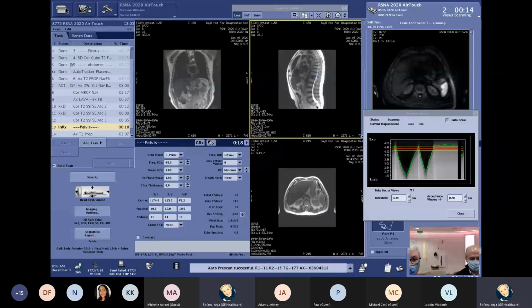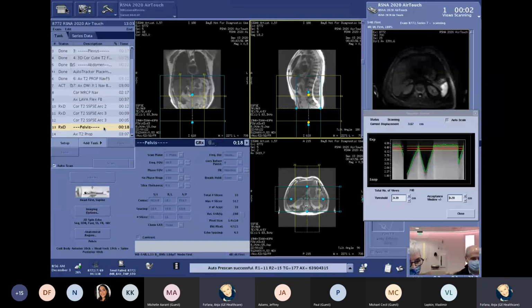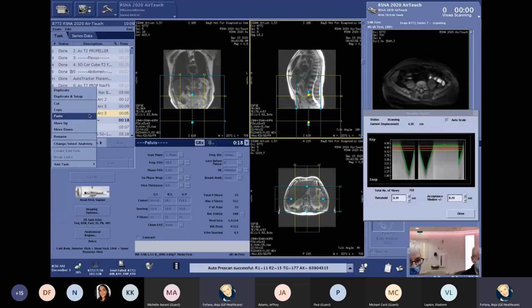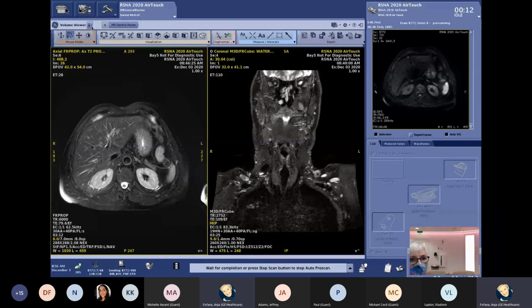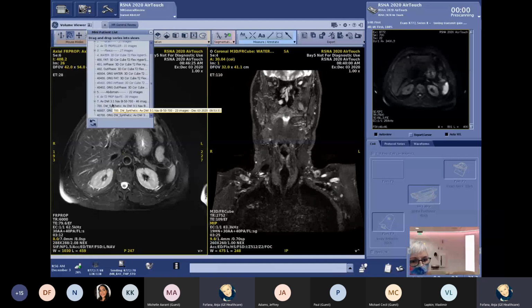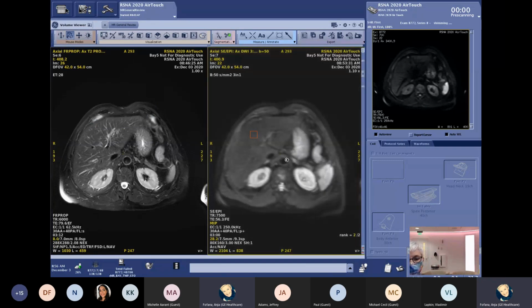Okay, and then I think we want to go ahead and end our session with just doing one scan in the pelvis, and therefore, again, I will run my localizer down in the pelvis area here. I will delete the other ones. And I will upload the diffusion sequences here as well. So here you see the B50 value. You can see it in the upper right corner, and I will go only to one slice.